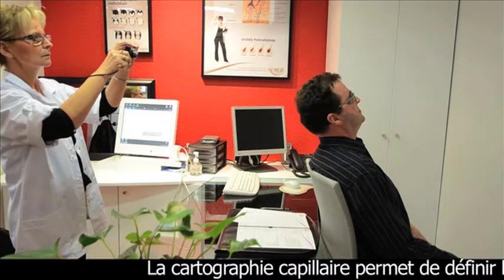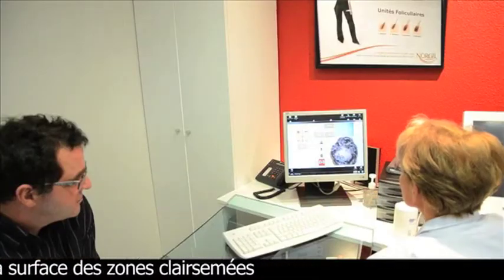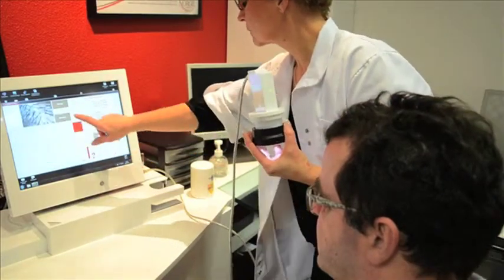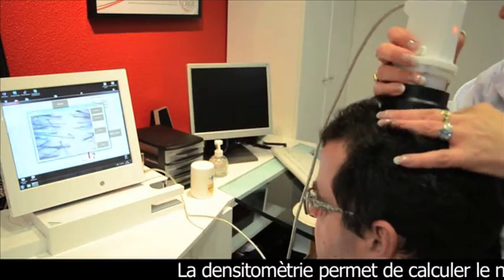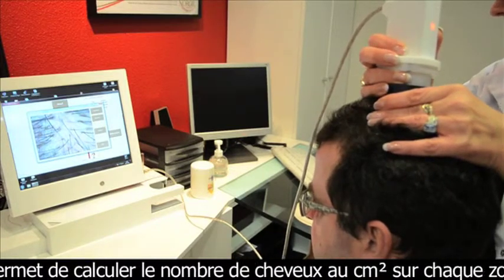To find out what their hair volume is, we create capillary mapping, and this capillary mapping will allow us to measure the bald patch or the area with alopecia, or sometimes both. Sometimes we have a bald patch with a little duvet around it. And this will allow us to evaluate the number of hairs per centimeter squared, which will then allow us to do comparison after a treatment to see the change.